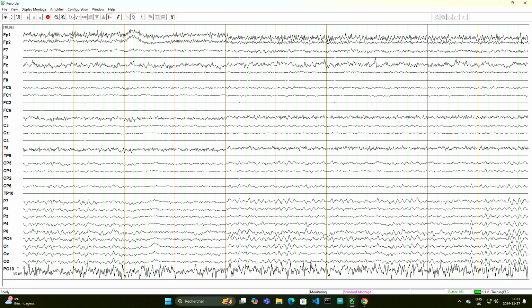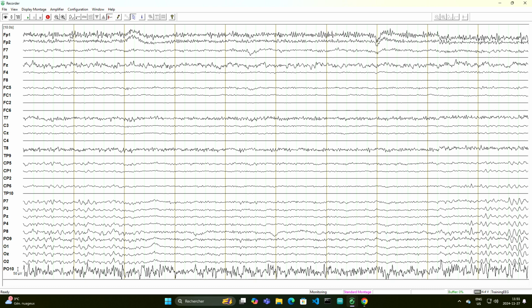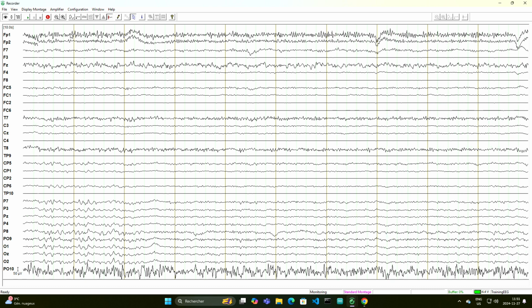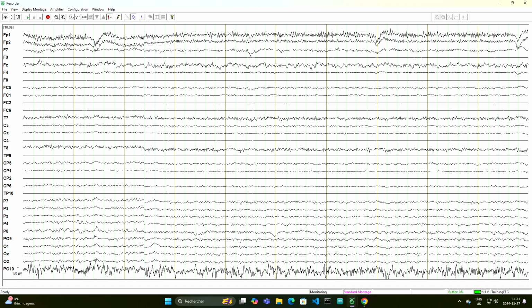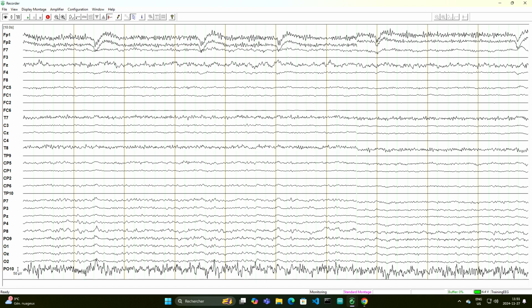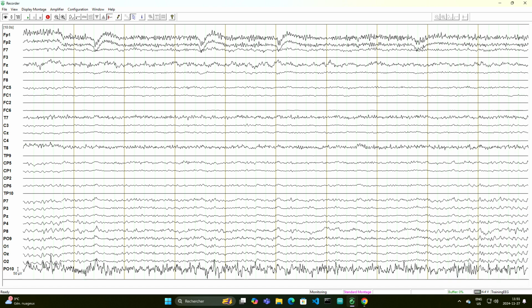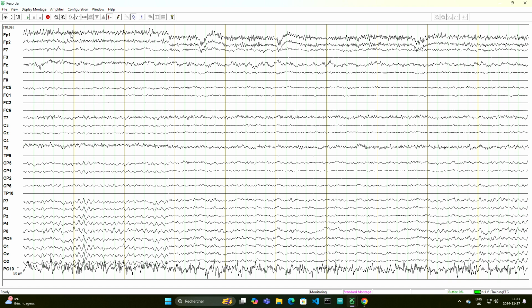This is harder to see because this is not physiological, this is neurophysiological. Open your eyes. But you should be able to notice, particularly around P7 to PO10, that as Anne closed her eyes, the amplitude of that signal increased ever so slightly.